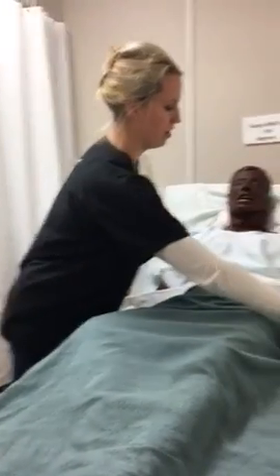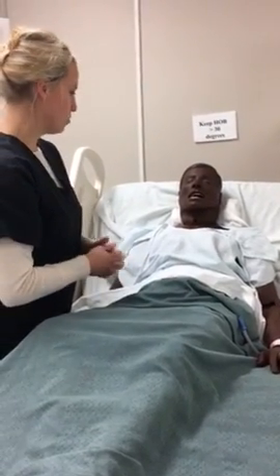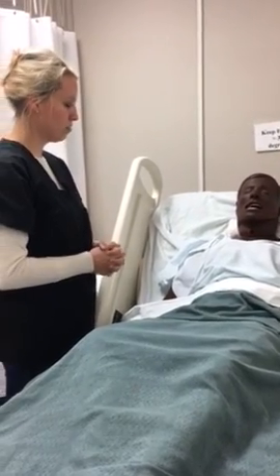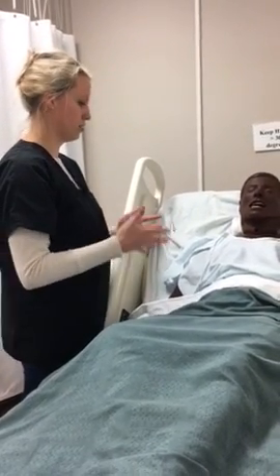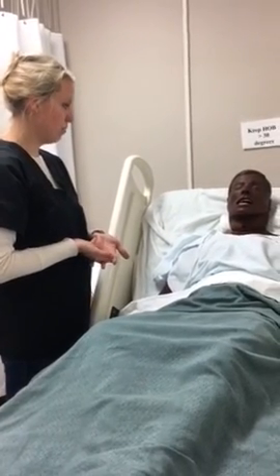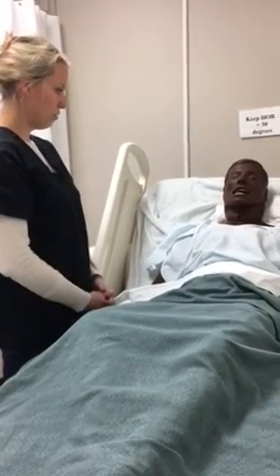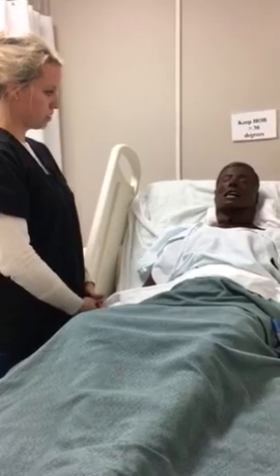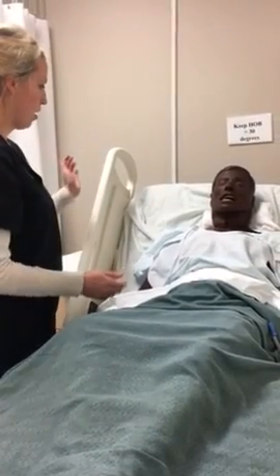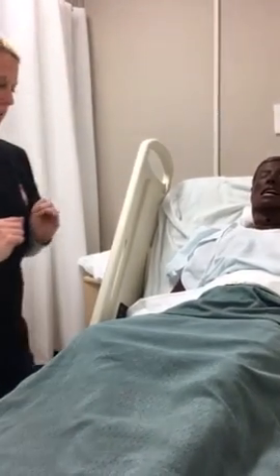So I'm going to verify name and date of birth, or the patient can verbalize name and date of birth. So Mr. Templeton, we're going to do an NG tube placement today. And the reason that we're doing that is because you have a bowel obstruction and this is going to help your GI tract. Do you have any questions before we get started? Okay, no questions. Also, are you good with us doing that NG tube placement right now? So I'm getting consent from the patient.